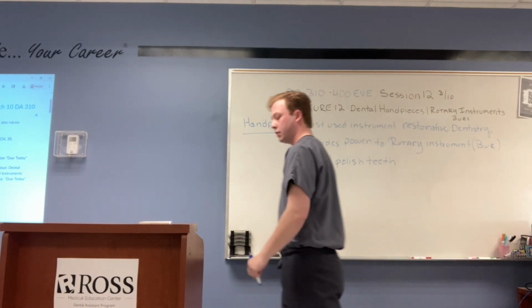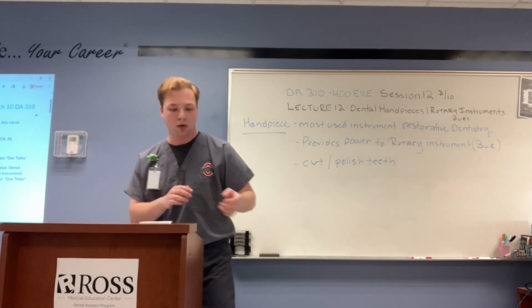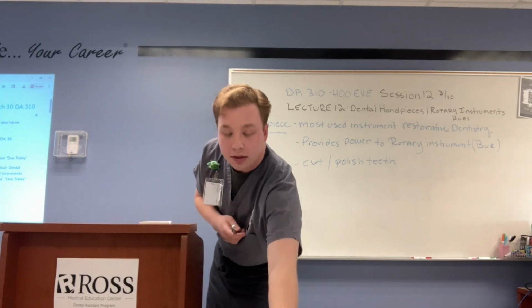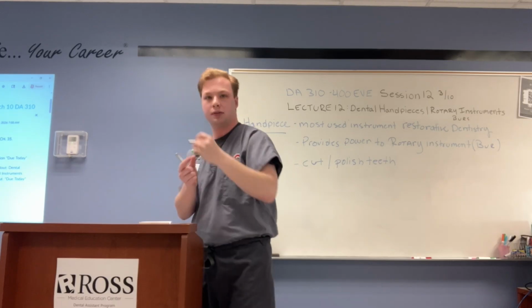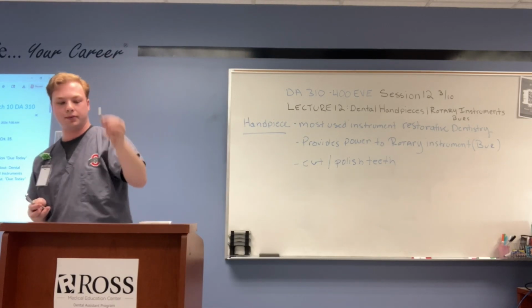Okay. So those are the handpieces, the actual thing you're holding, right? This is a handpiece. This is the handpiece, and this is the handpiece, okay?